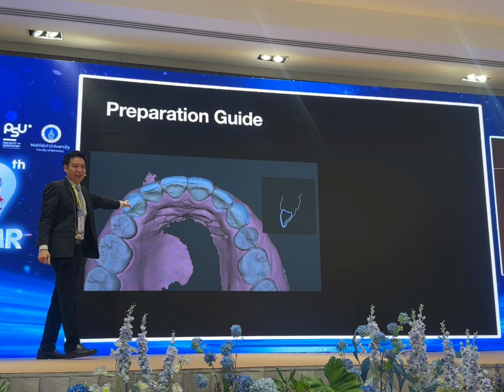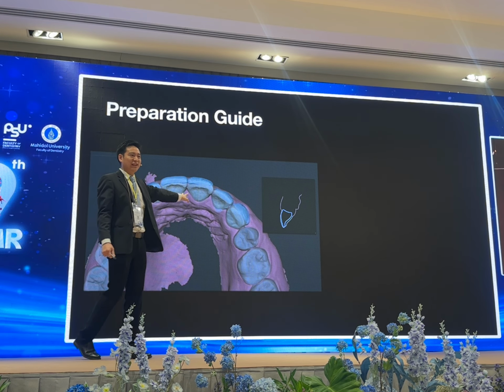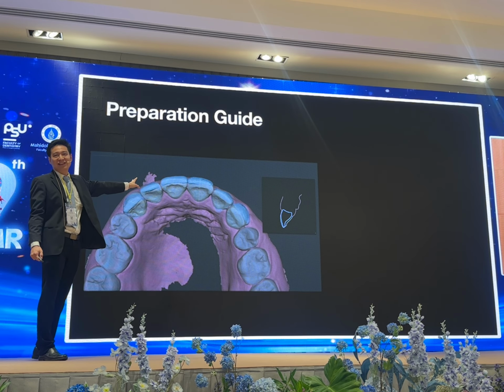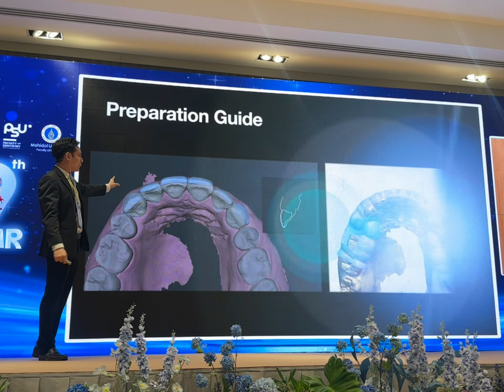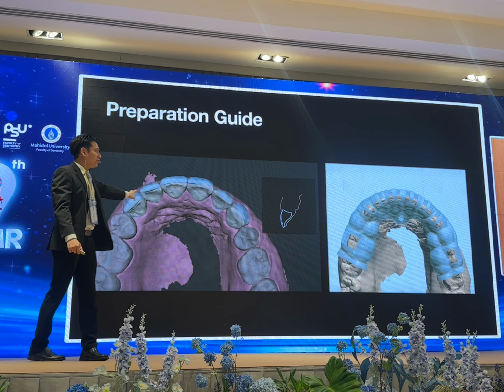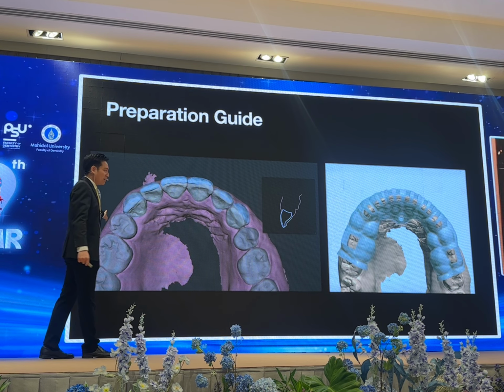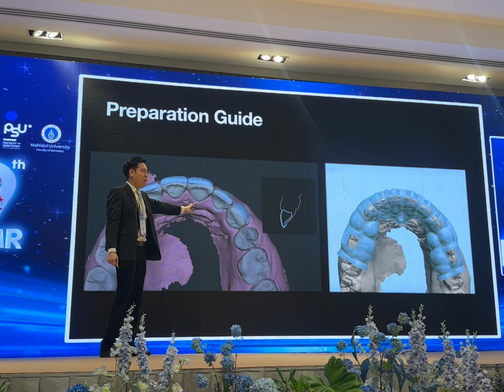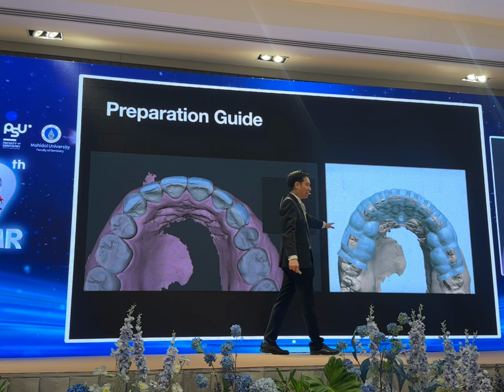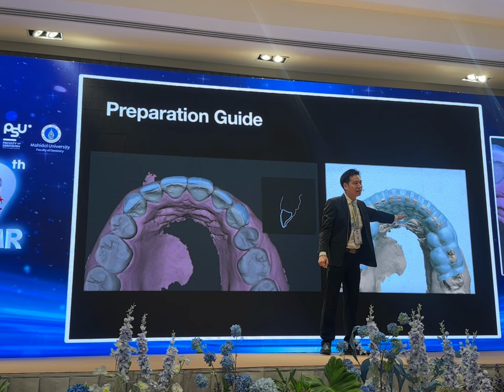Let you guess which direction we are heading in this case, conventional or digital guide. We came all along this way, so we decided to go for a digital guide. We use this information from the software, export it to make a 3D model, and with the exocad software, we can manipulate it and create the digital guide.